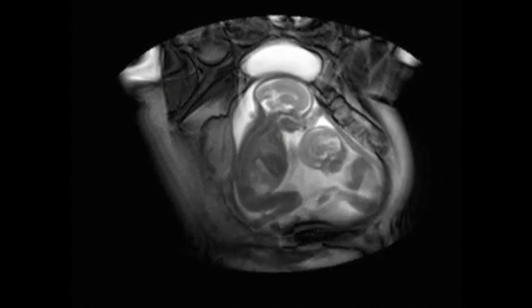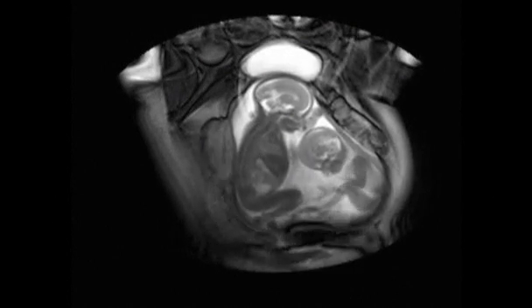We haven't really been able to see before in such real-time complete pictures how twins interact, and what this cine lets us do is see their positions in relation to each other, and how much space they have, how much space they occupy, how they might move and push each other out of the way. So that's something that you can see snapshots of on ultrasound and small parts of it, but you don't get the view of the whole room, as it were, the room being the womb.